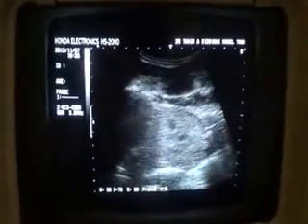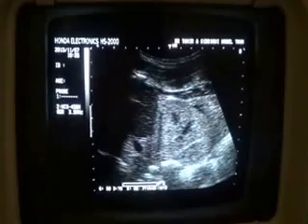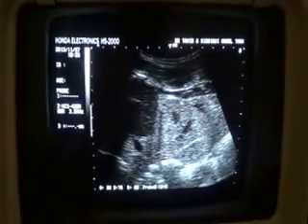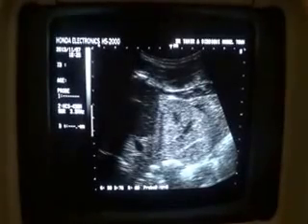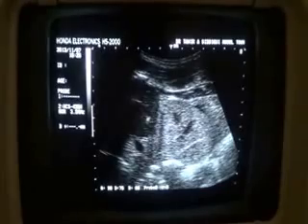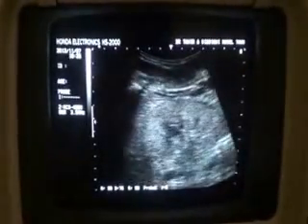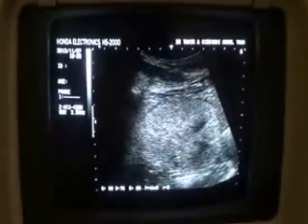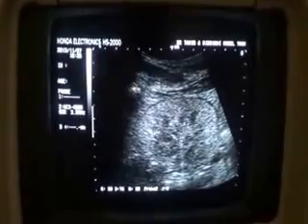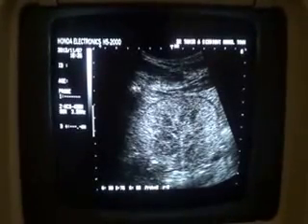Now I am going to focus on the right kidney, and again you will see that there is fluid in the subcapsular region. You see the capsule is muffled. This is the fluid. This is the parenchyma of the right kidney, and the parenchyma appears to have diffusely increased echogenicity. The corticomedullary differentiation is again muffled in this kidney. This is a small amount of fluid below the capsule, the subcapsular fluid.